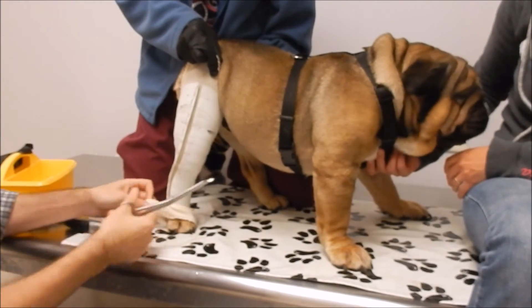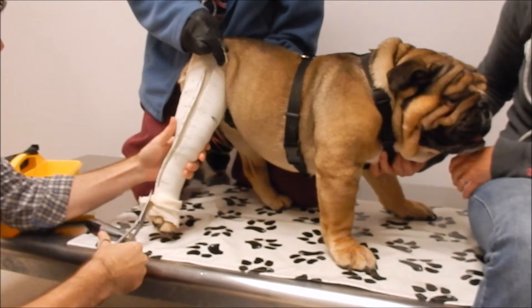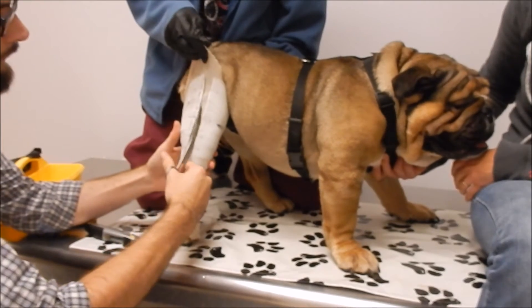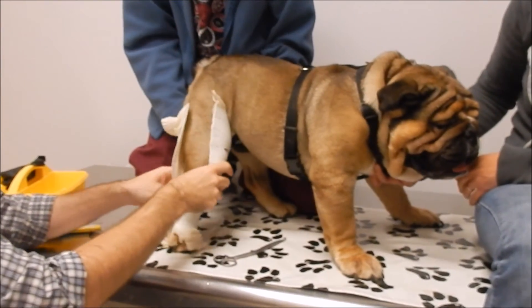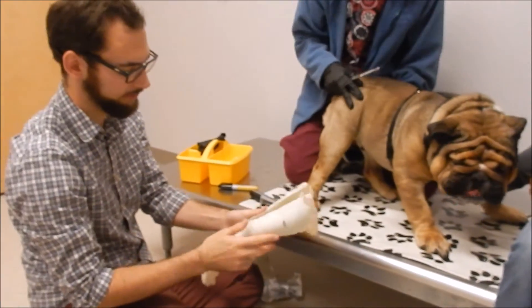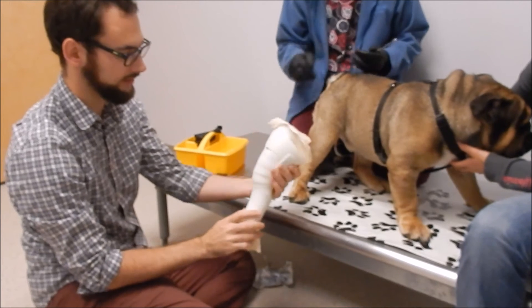I need to take my stocking off, so I have my cast scissor. I'm going to cut the fabric and then gently slip the cast away. It's semi-soft still, but it's going to be firm enough that I can hold it back together and be done. That's the cast.